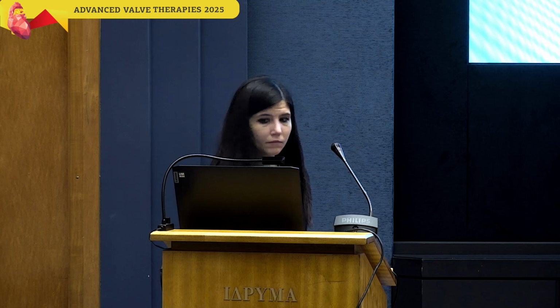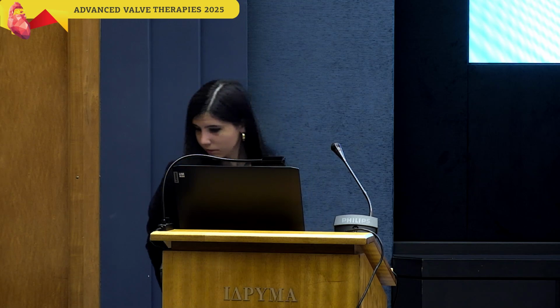Dr. Kalogeras. Congratulations for the case. Please, microphone. I think it's an Evolut. Would you think that because of the massive calcification, a Pro would avoid this happening initially? Yes. Because it was a perfect landing height, so obviously the calcium was the problem. So probably the Pro would be better for that, but we don't know. Yes, we saw it also in the Pro as well.